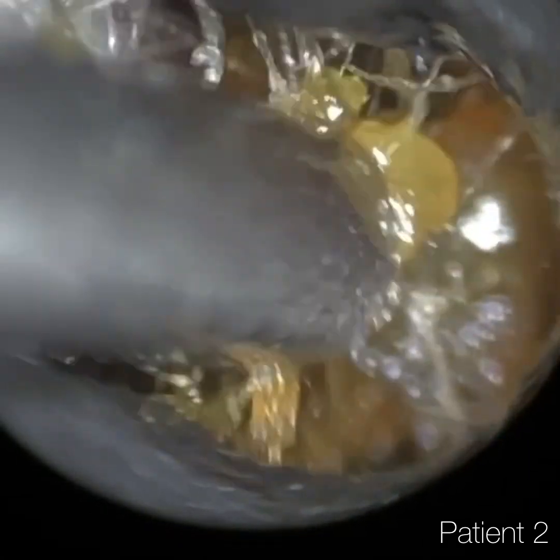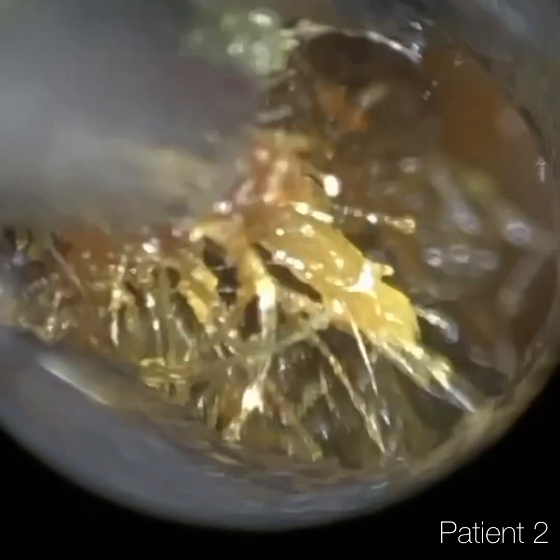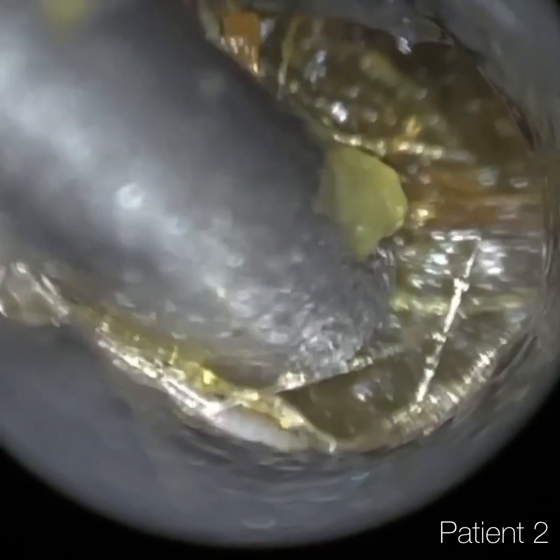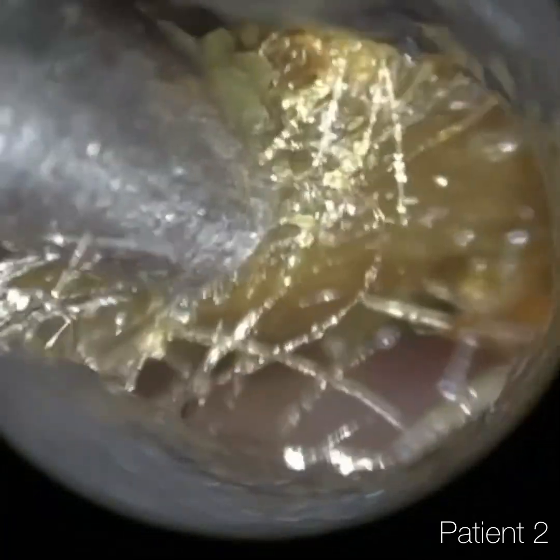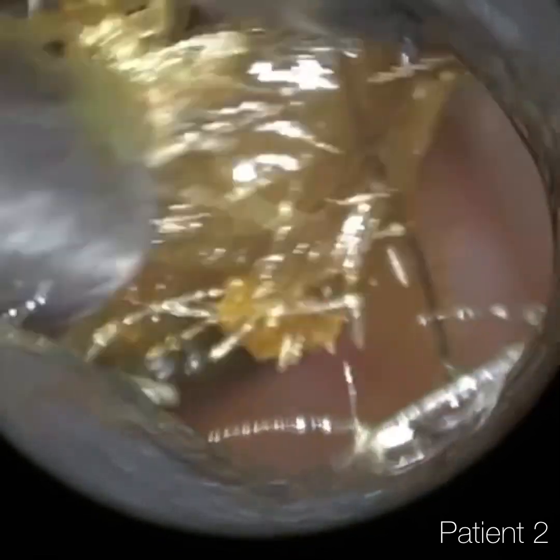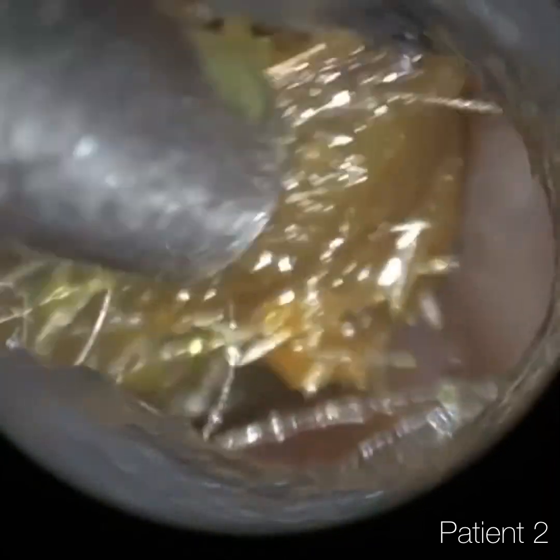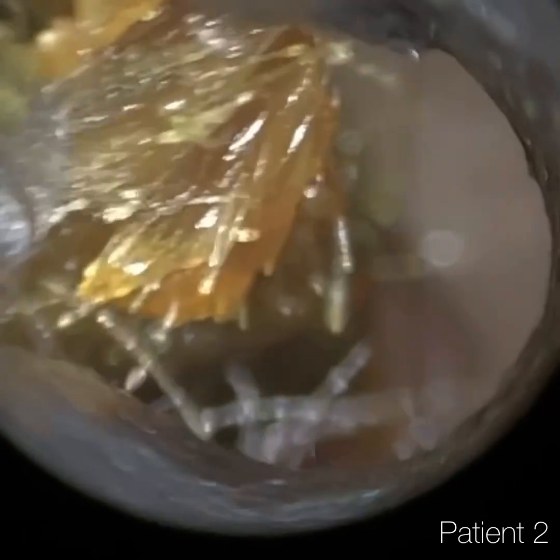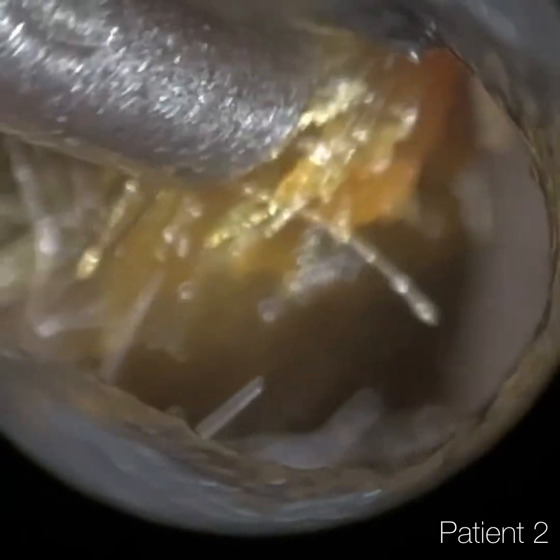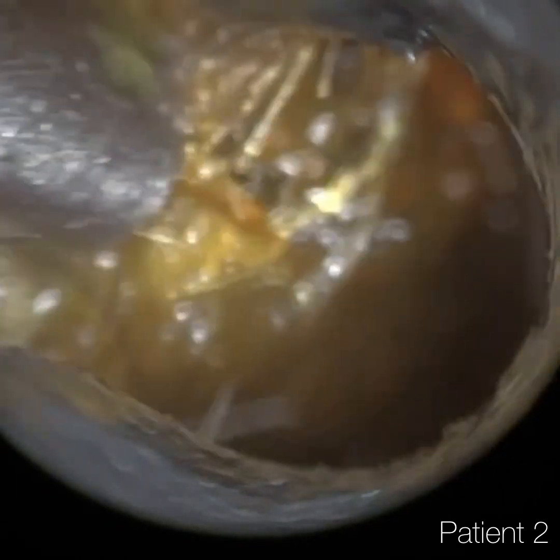So I'm just more at the roof of the ear canal, just trying to bring this wax plug downwards. You can see the motions there — I'm just getting a suction grip and bringing it down, almost tucking it under the top part of the cartilage. The cartilage at the top has almost enveloped itself around the plug of wax. So I'm just trying to bring this under the cartilage so I can release it and then bring it forwards. And it's slowly coming away now. I'm just trying to curl it around the first and second bend of the ear canal.